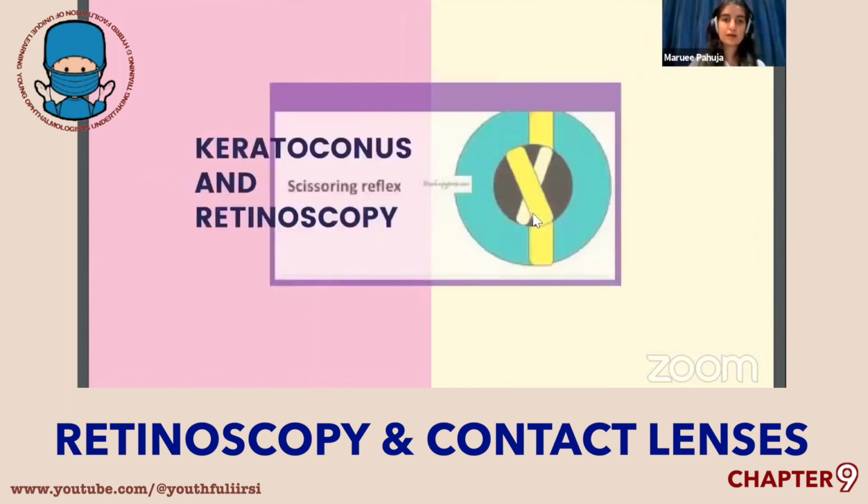Just getting a little glimpse of keratoconus and retinoscopy. It's a little tricky to do retinoscopy in keratoconus, but a really important step. We see the scissoring reflex in keratoconus when retinoscopy is done. Why am I speaking of keratoconus specifically right now?